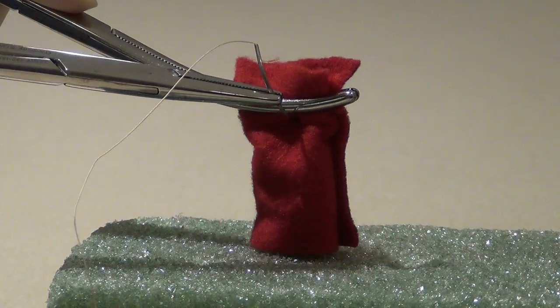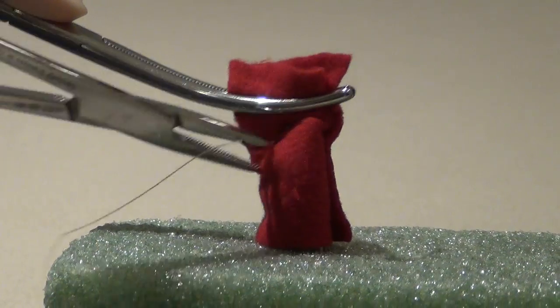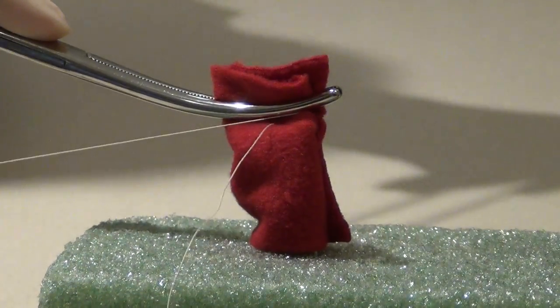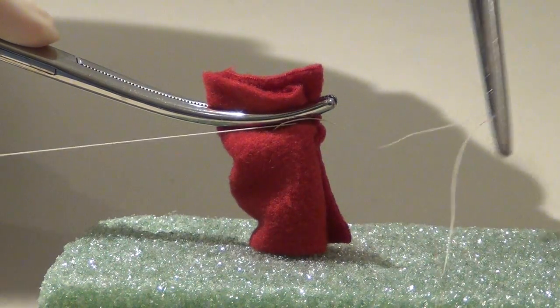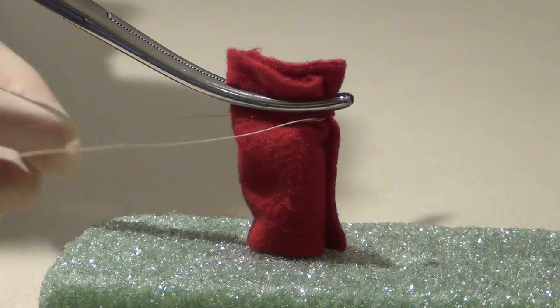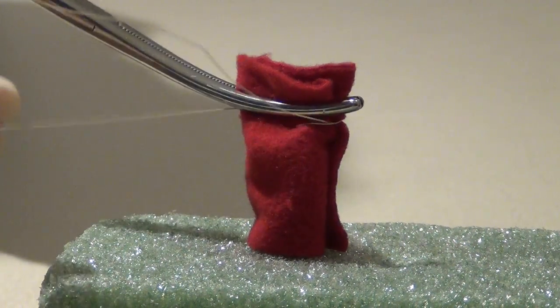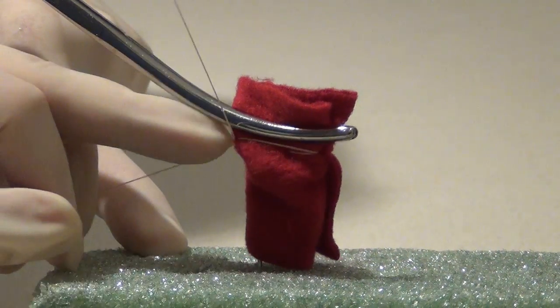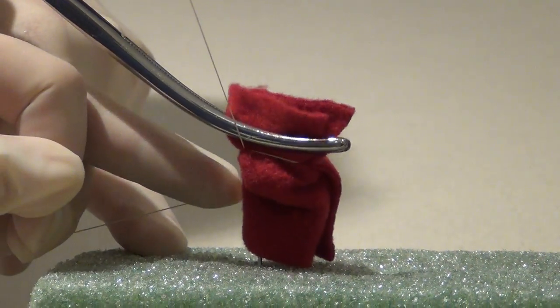In the fore and aft stitch, the suture is placed through the middle of the pedicle underneath the clamp. It is then removed and brought around the front of the pedicle. The other tail is brought around the front of the pedicle in the opposite direction. The two tails are then tied behind the clamp at the back of the pedicle, and once the knot is tied down securely, the clamp is removed.